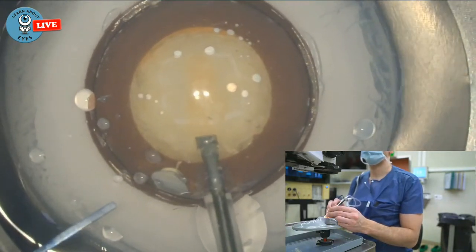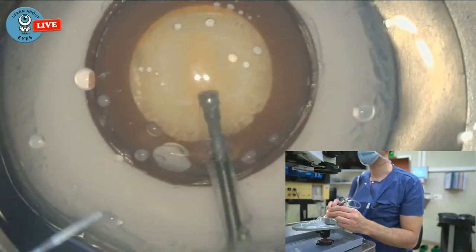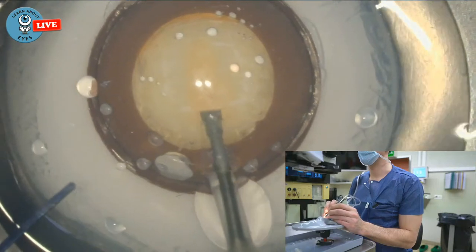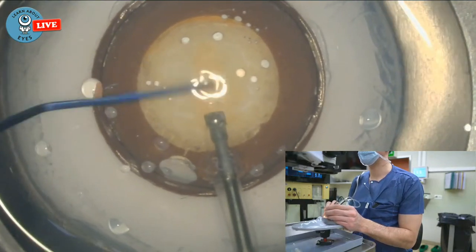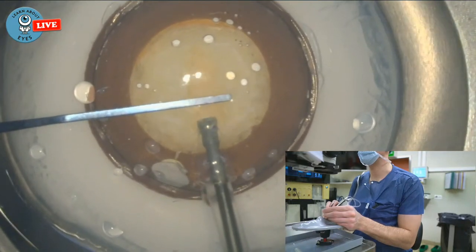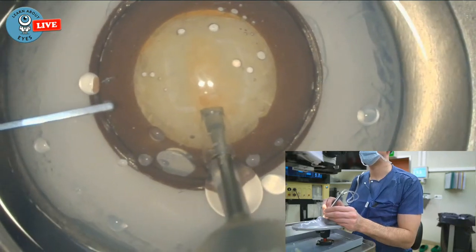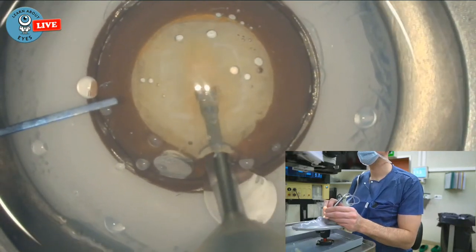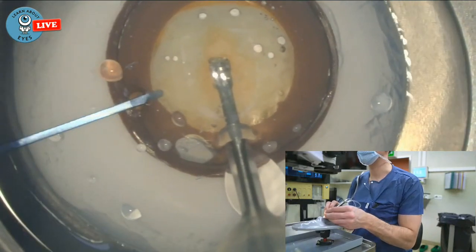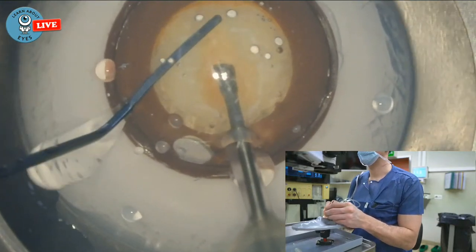And now, what I definitely want to show you guys, or show myself, because it's the thing that everybody always does wrong, including me, is you kind of think that the middle of the lens is here, or you end up with the deepest part here, but it's supposed to be here. So you really want to go in steep. You want to hold your phaco tip very steep and go grab that part of the lens. Usually you would have your second instrument in there and you would find your paracentesis. Just keep it down here.